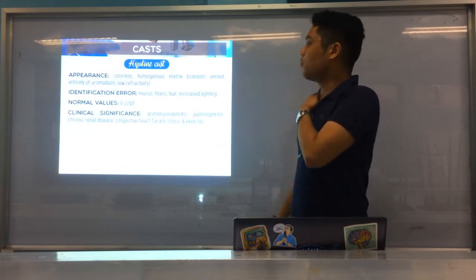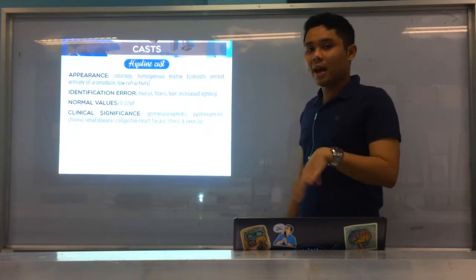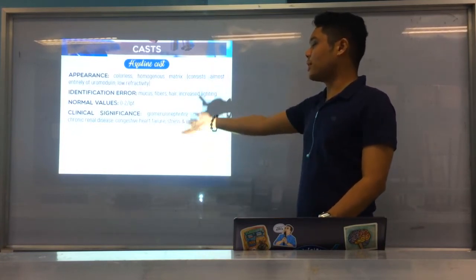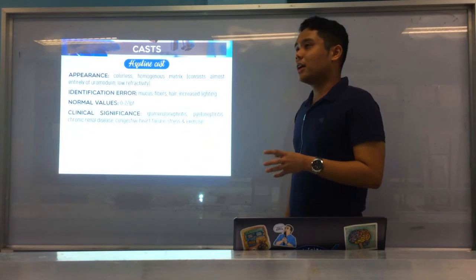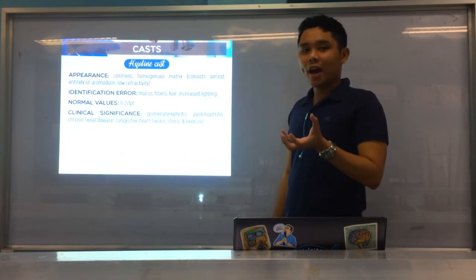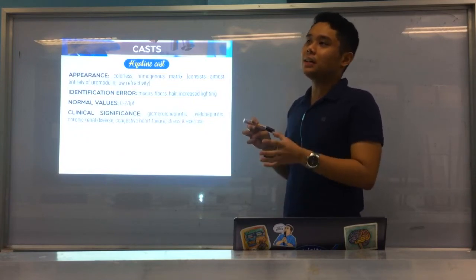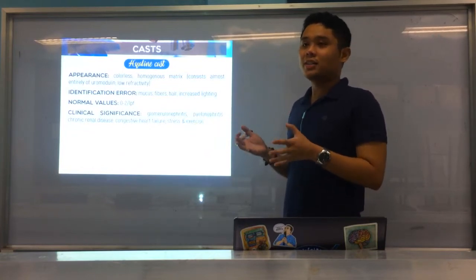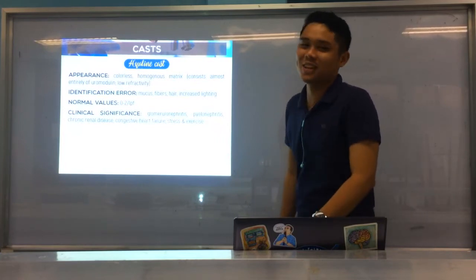urine usahay, okay? But the pathological significance also, it could be glomerulonephritis, meaning inflammation of your glomerulus, pyelonephritis, infection, bacterial infection, chronic renal disease, congestive heart failure, stress and exercise. Congestive heart failure, when you say congestive heart failure, parang dili na kayo maayo mo-pump og blood, okay, ang heart, padulong sa kidneys. Therefore, wala kayo blood na masulod sa kidneys, okay, so na urine stasis or dili kayo ma-filter. That is why pwede siya makacreate og hyaline cast, okay, so magpadayon siya, increase iyang uromodulin production until ma-form siya hyaline cast, I think. If wala ko na sa akong explanation sa congestive heart failure, okay?